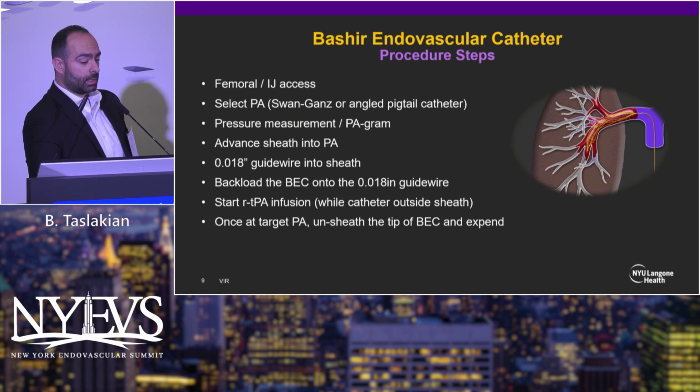For this specific device, because it's easy to fix on the legs of the patient, because you always have to think about dislodgement of whatever device you're keeping in the patient, especially when you're sending the patient from an interventional suite to the MICU or observation. So I found femoral access is, for this specific case, easier or safer to use. But there are people who use IJ access.